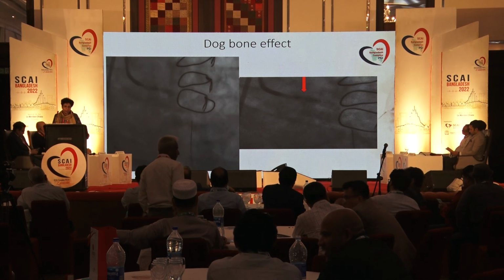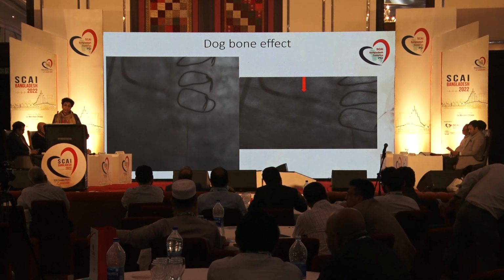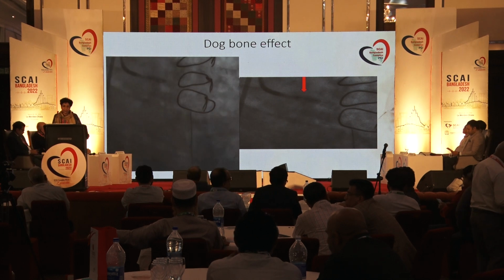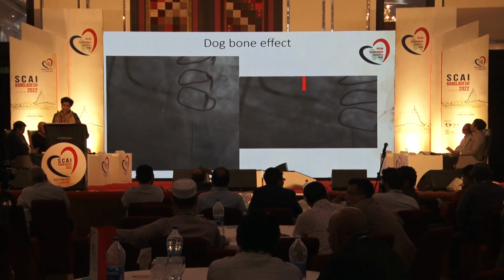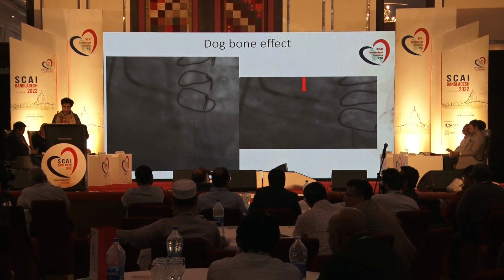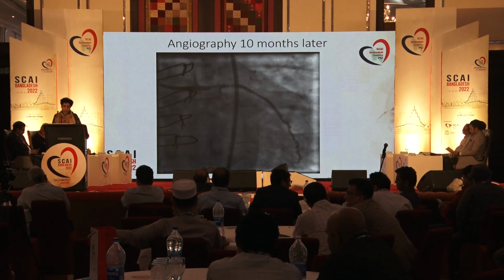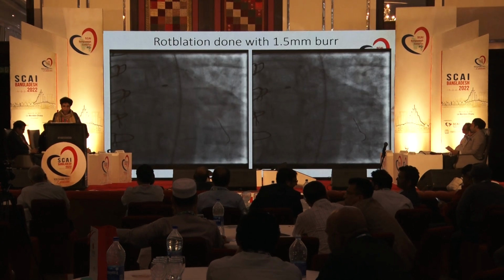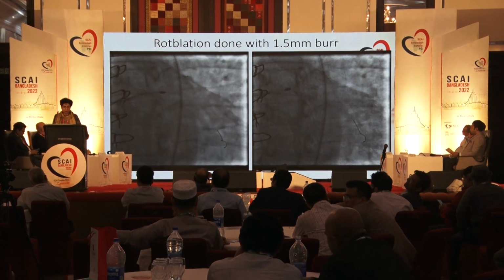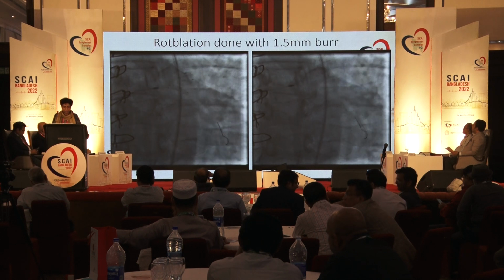And so they did a PCI from left main to OM, but unfortunately, the lesion was not properly prepared, and as you can see, it was dogboned, and the stent did not open up properly. They left it that way, and soon, 10 months down the road, the patient developed in-stent stenosis. So this patient now came to our hospital, and here we did rotablation of the stent with a 1.5 burr.